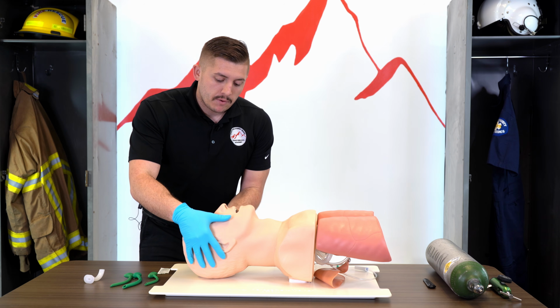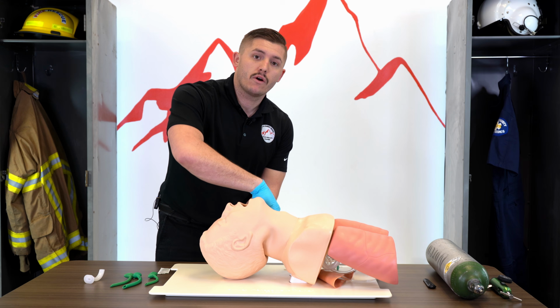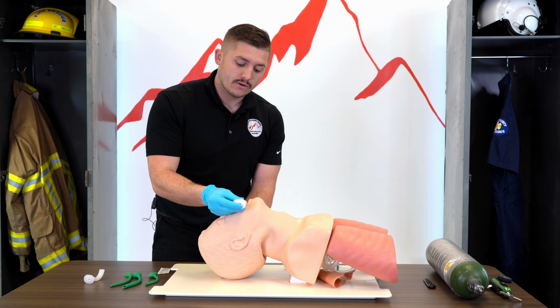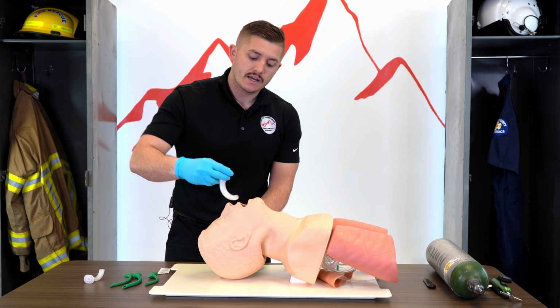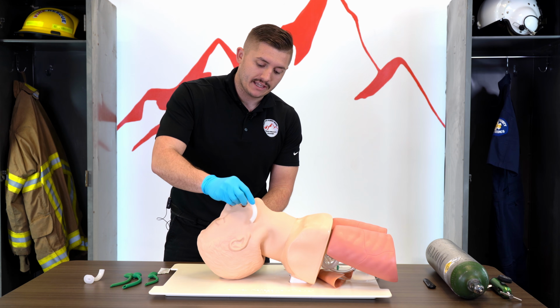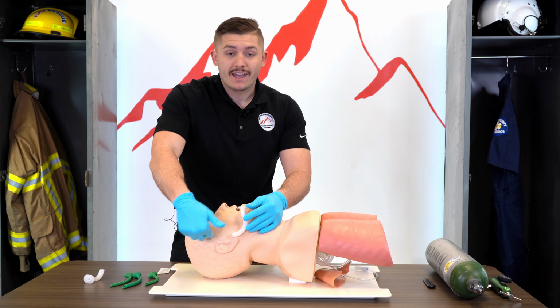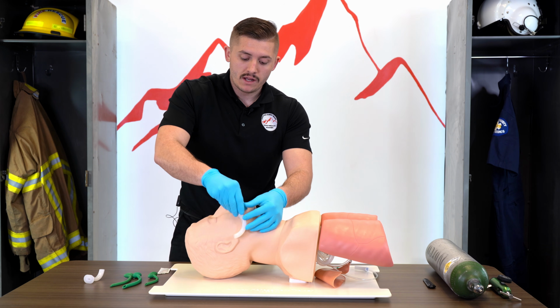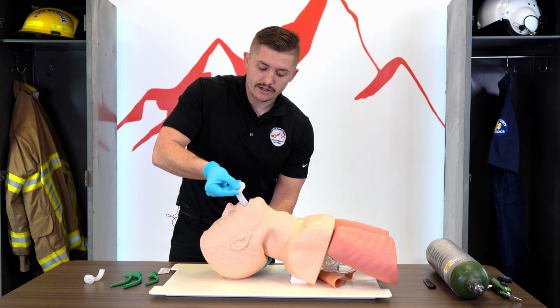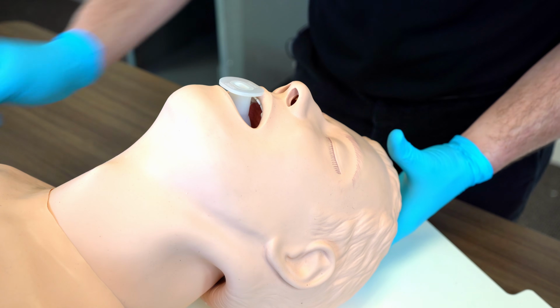So we're going to open up our patient's airway with our head tilt chin lift, which takes the tongue off the back of the throat, so we're already helping our patient. And now I'm going to place my OPA. I like to go at a 90 degree. A lot of people will do 180 degrees. But let's think about the anatomy of the oropharynx. If I place this OPA like this, it's going to sit in here like this and give air up here. It's not going to fit at all. So I want it to sit like this when it's inside. So 90 degrees. I'm going to kind of scoop that tongue out of the way. I'm going to turn it and place it.